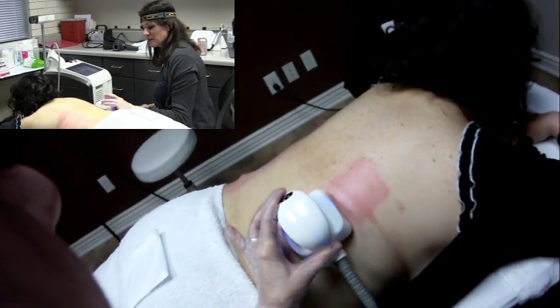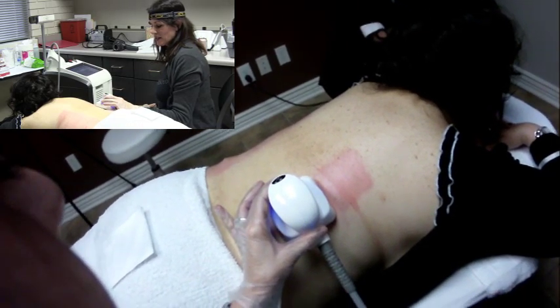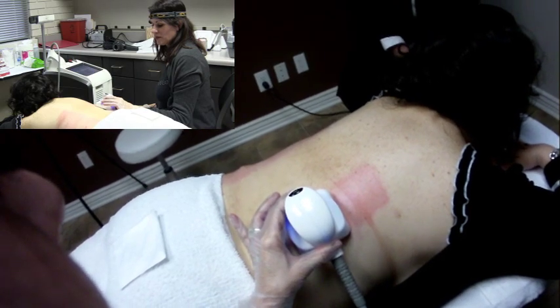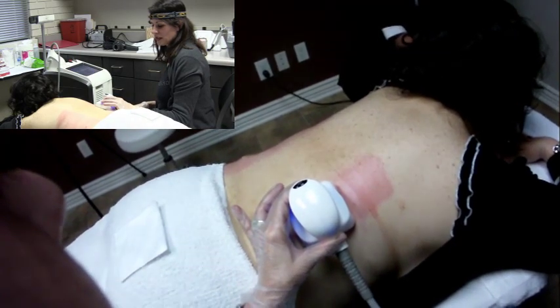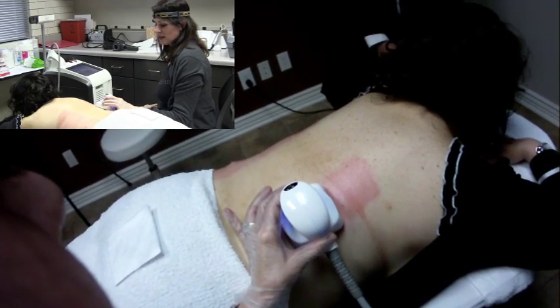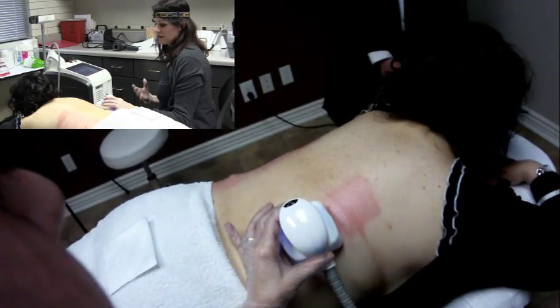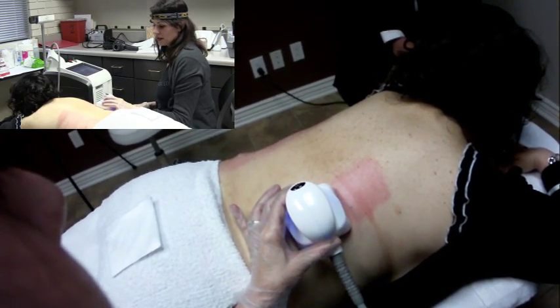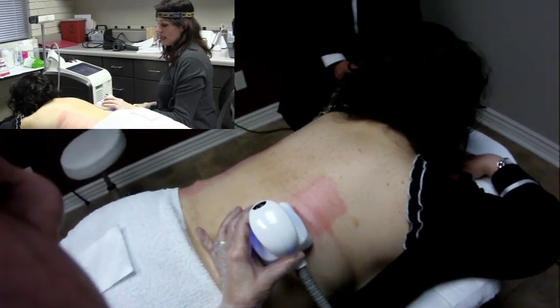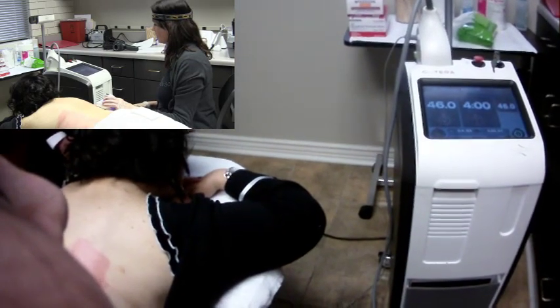But it's going to be me later on — yay for me. So what this is is a monopolar device — mono meaning one — so we have the other pad grounded underneath our client. This is a device that is designed to help reduce fat in an area. You can see the area we're treating on our client's back right now. I've already done two areas and I'm on to my third.